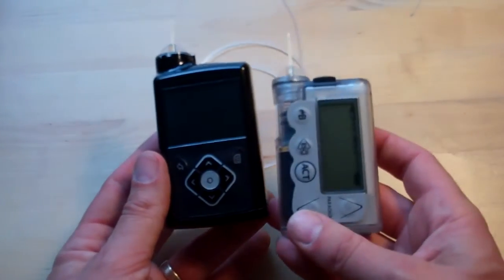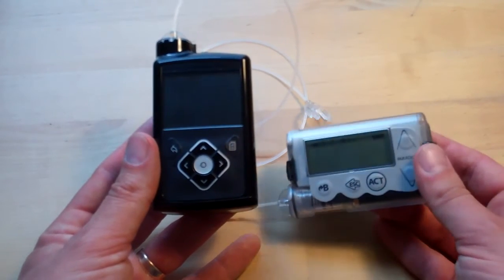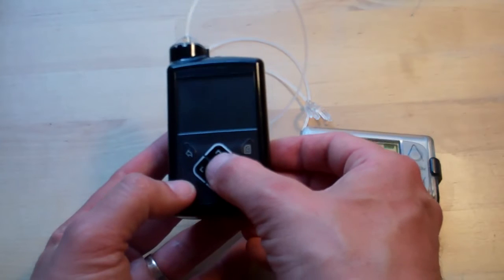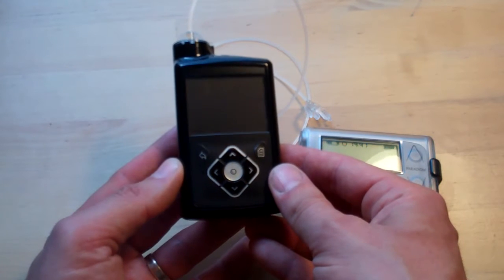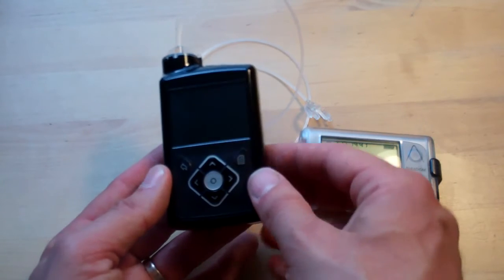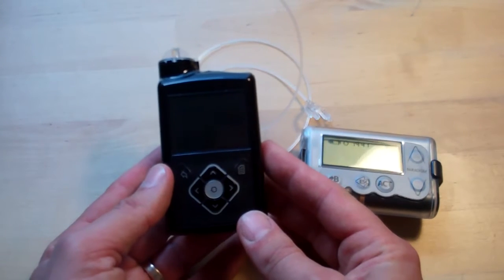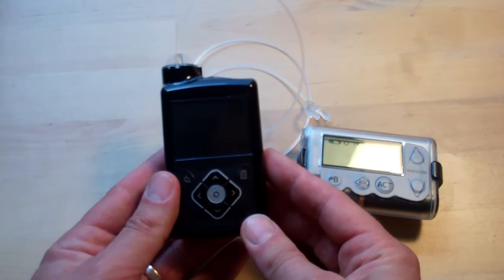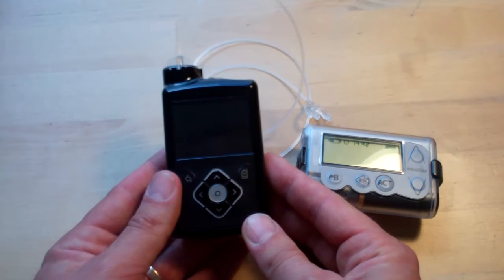A couple of obvious changes: they've changed the orientation — it's gone portrait rather than landscape — and they've included a lot more buttons. There's a four-way controller with a central OK in the middle, and then a menu and a back button. They've really gone overboard reworking the user interface with a great deal of success. I think they put a lot of thought into it, and they've tried really hard to make the menus logical and to put things kind of where you'd expect them to be.